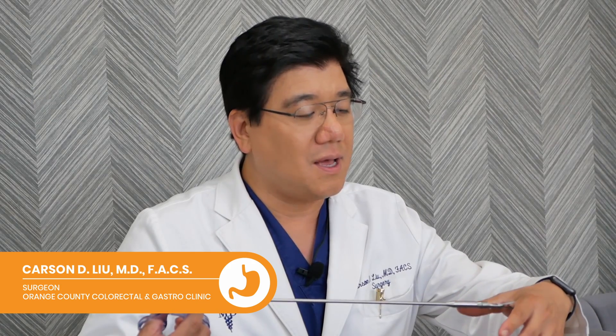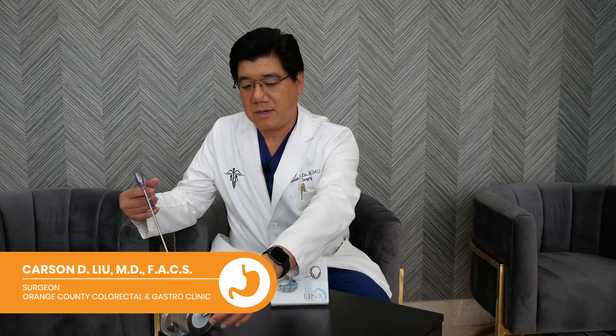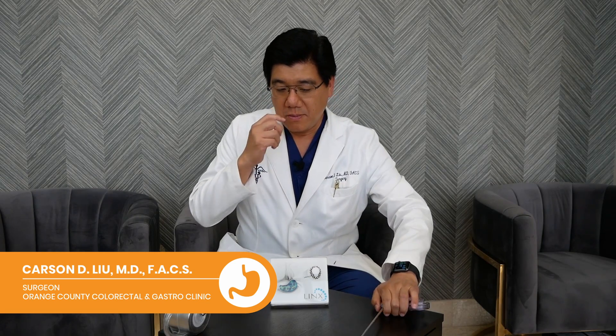This grasper here will act like an assistant surgeon, retracting tissues in a non-traumatic way. We're able to grab tissue and it can hold and basically retract tissues with a strong magnet right here, allowing us to pull away tissues so that we can operate as the primary surgeon.